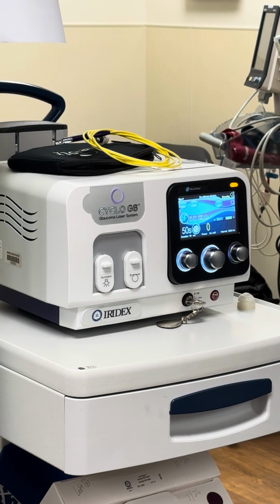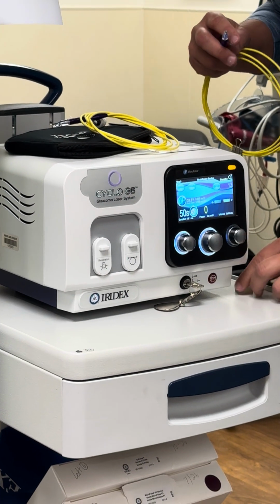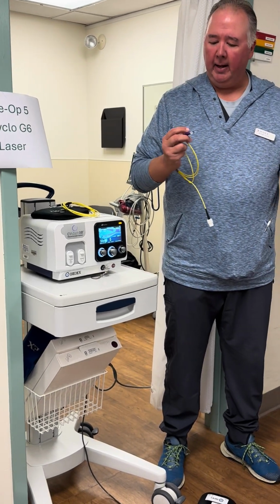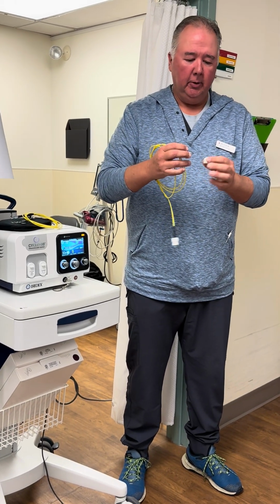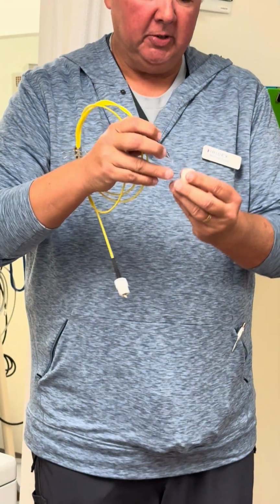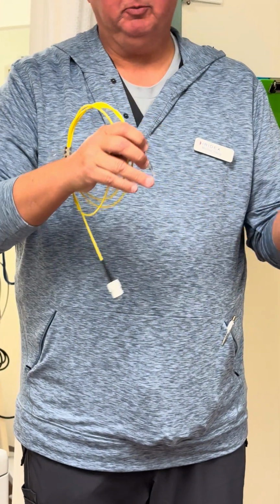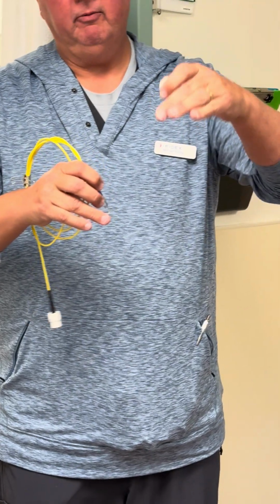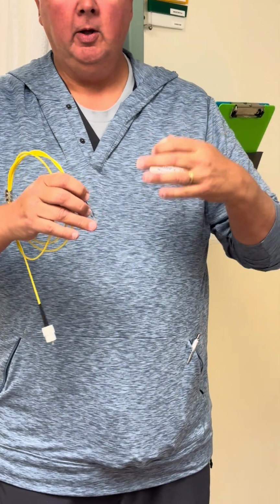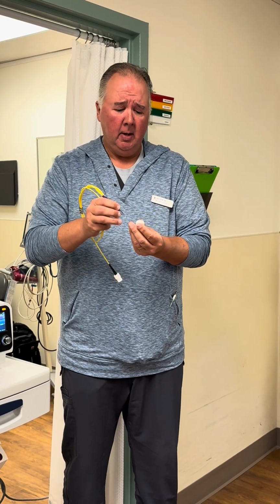These are the fake ones. So the micropulse, essentially what this is doing is, like I said, you're moving your hands slowly across a flame. They're doing this in quadrants. They're essentially going from 12 to 3, and then from 3 to 6, from 6 to 9, from 9 to 12, but they're doing each quadrant 4 or 5 passes with this. It's called sweeping technology or sweeping management.